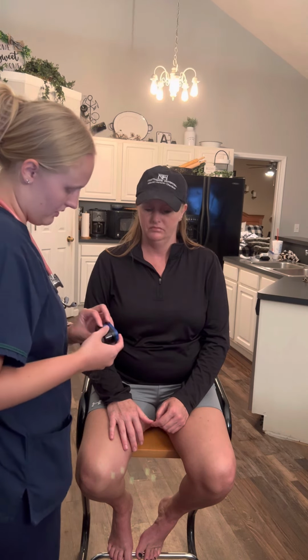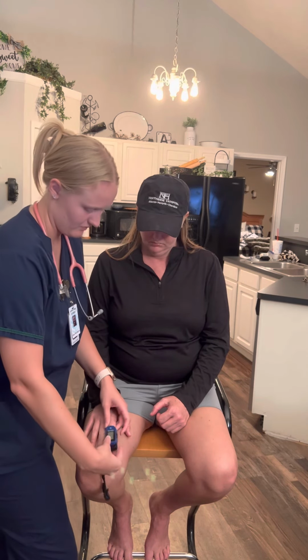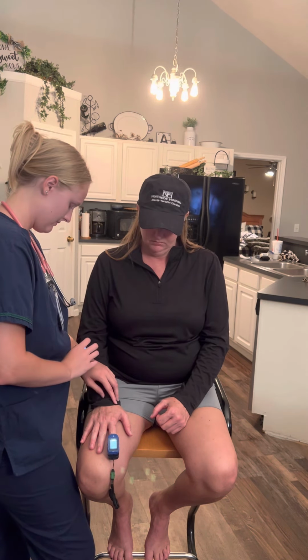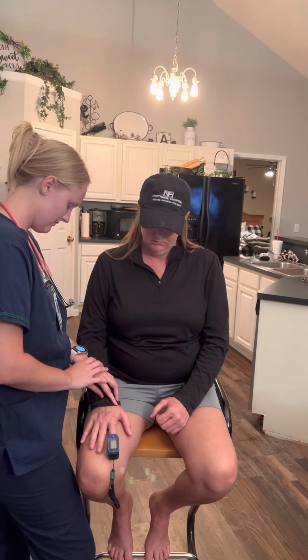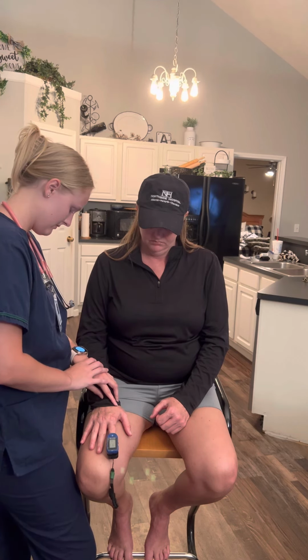Now I can check her pulse ox, and while I'm doing that, I will also assess her respiratory rate. Okay. Her respiratory rate would be 15 and her pulse ox was 97. So both are within range.